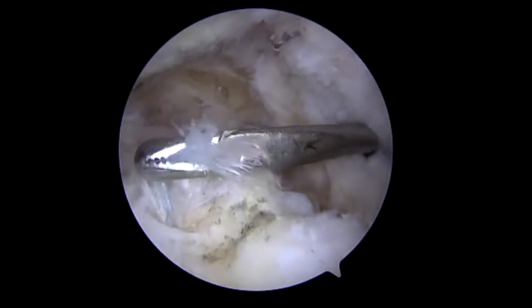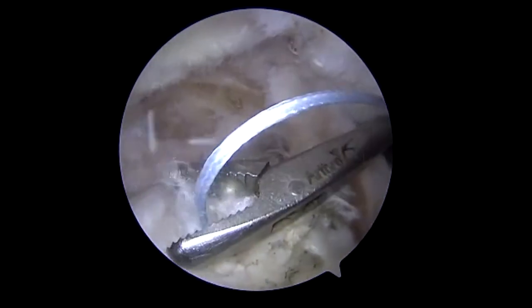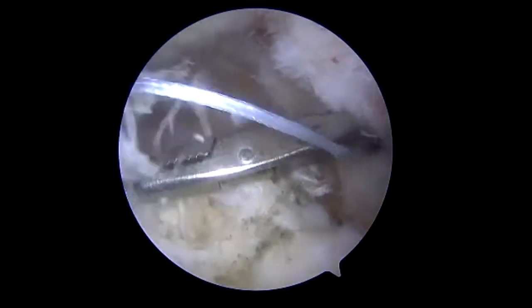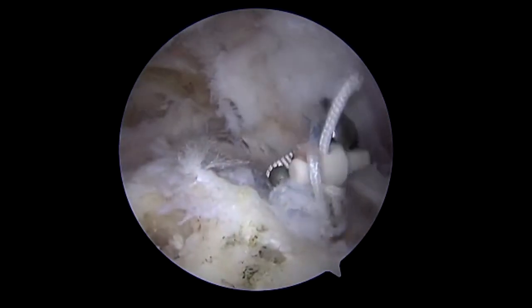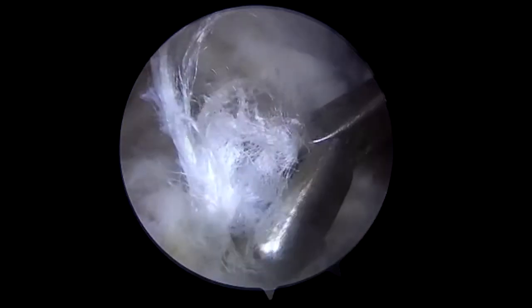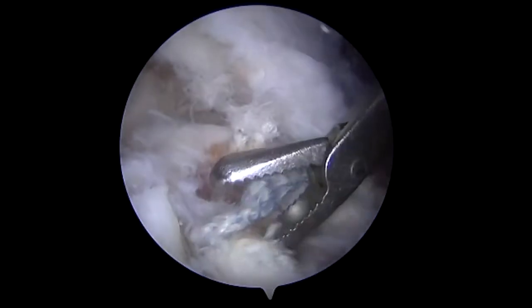It should be noted that the SCR is an indicated procedure when the patient does not have arthritic changes yet has an irreparable rotator cuff lesion. We see the anchor being removed, and we will have to place the anchors more laterally. This patient was too young and active to go immediately to a reverse shoulder replacement — this is essentially a salvage procedure.